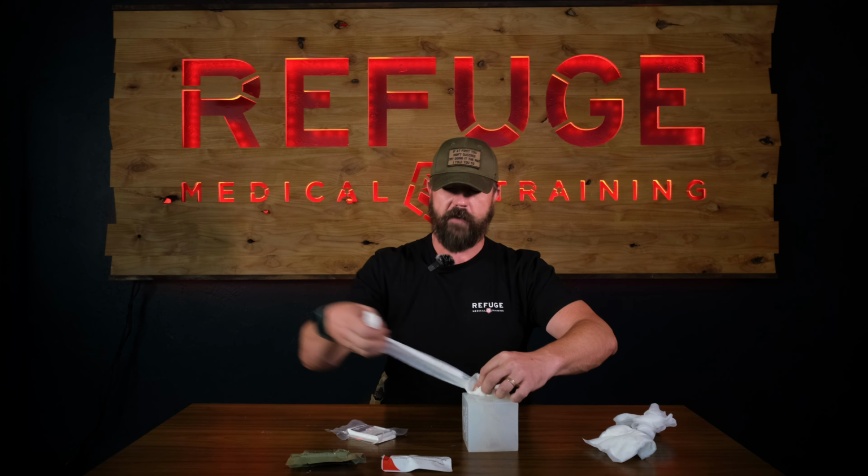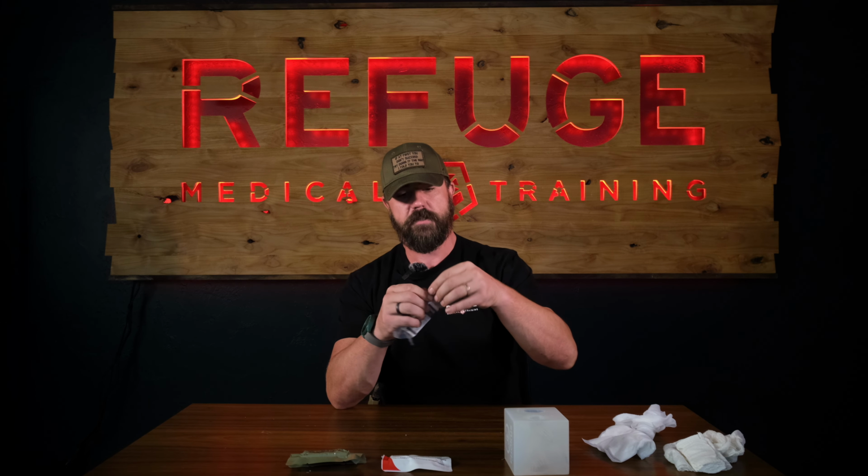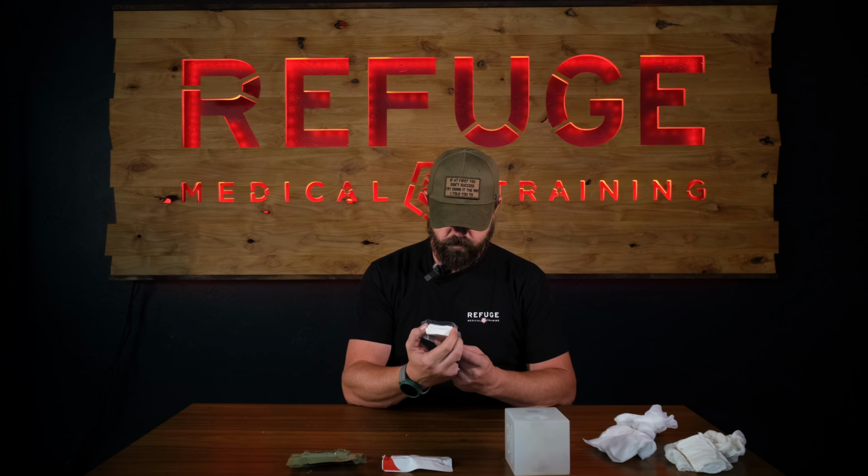Well, as I do, I have to pull out more slack, and with this rolling, some people can lose their grip on that. Under stress especially, you lose some dexterity. The other option for compressed gauze typically is Z-fold, which I am a very large fan of. This one is, again, 6-ply.